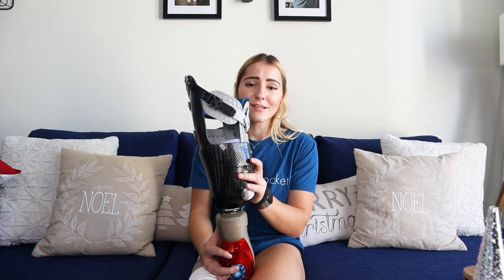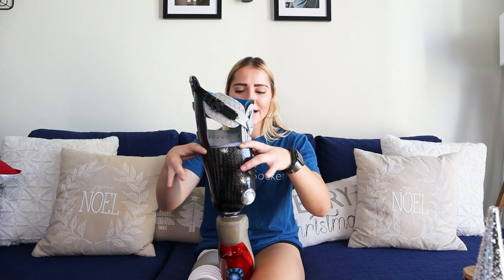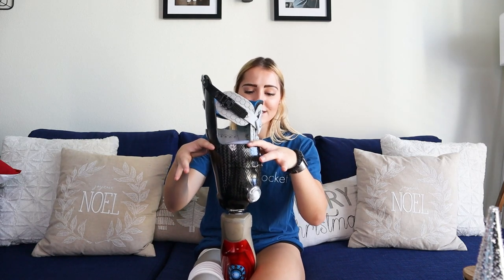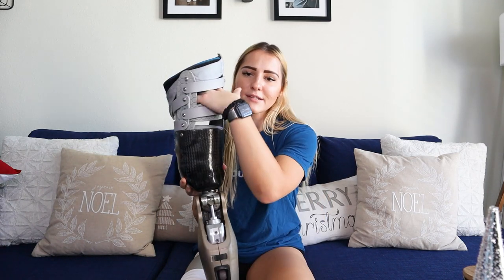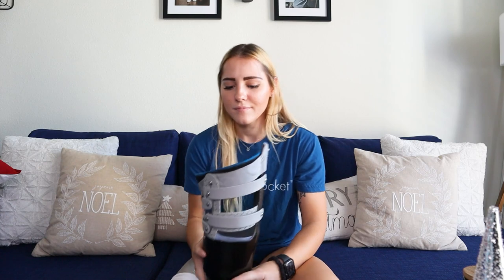I chose to go with the vacuum system again because I really liked the suction and wanted to keep that. You can see that just where the suction is, that's where the carbon fiber is. But you can see all these spaces — and that's been life-changing in and of itself.